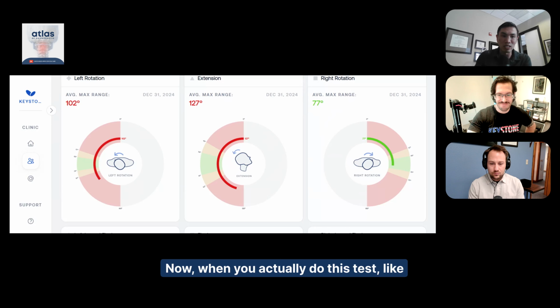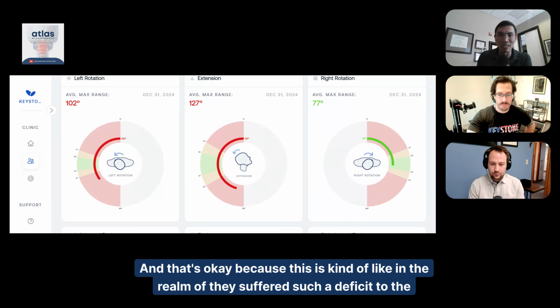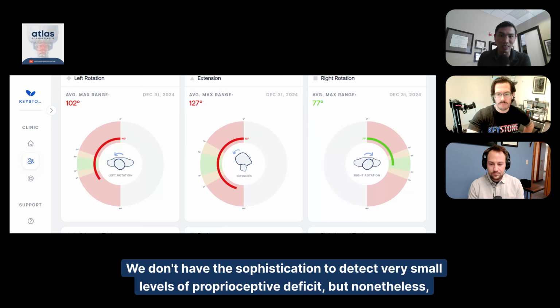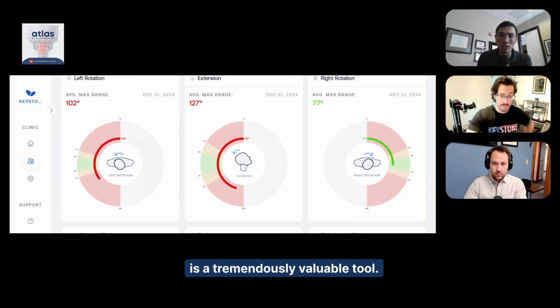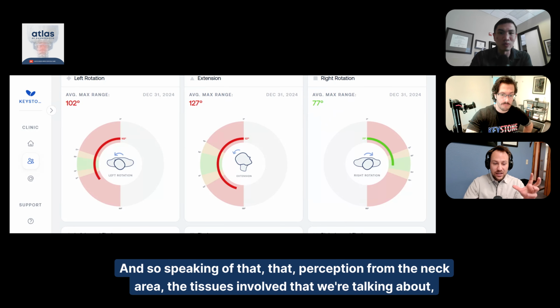Now, when you actually do this test, we might not see that a lot of our patients have big joint position errors. And that's okay because this is kind of in the realm of they suffered such a deficit to their proprioceptive system from a trauma that it caused it to be able to detect error at this level. We don't have the sophistication to detect very small levels of proprioceptive deficit. But nonetheless, especially if you are working with a concussion patient population, a whiplash patient population, I think this is a tremendously valuable tool to help us see what's going on, how the brain is perceiving the mechanical reception from the neck area.